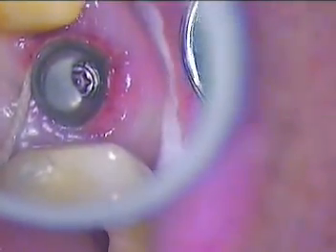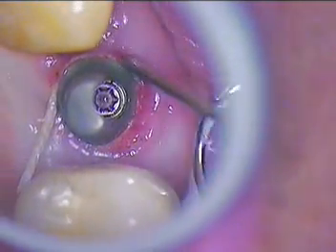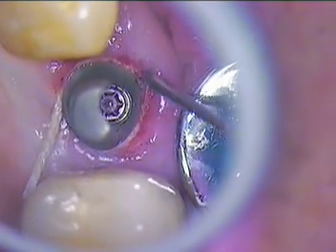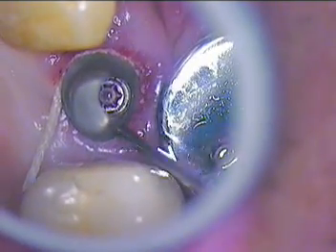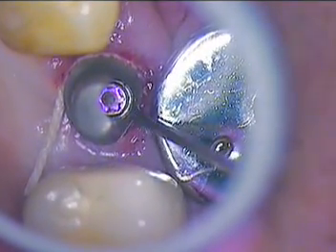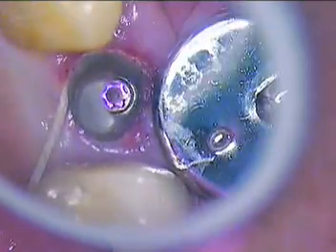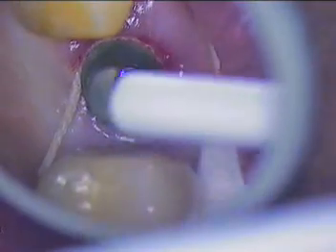Now let me have that suction tip. You can almost just hear it — it's just suctioning. I don't have any tissue tags to worry about. I'll just add a little bit of dry air. I'm going to dry gently. We're going to go right in with cotton now.